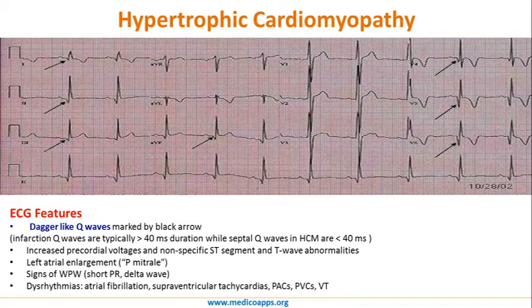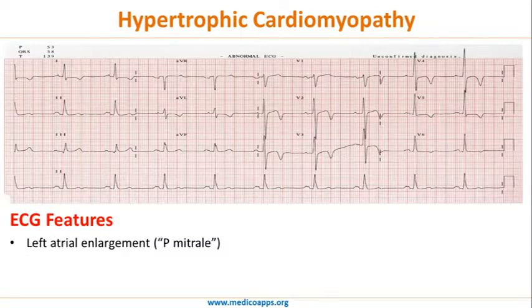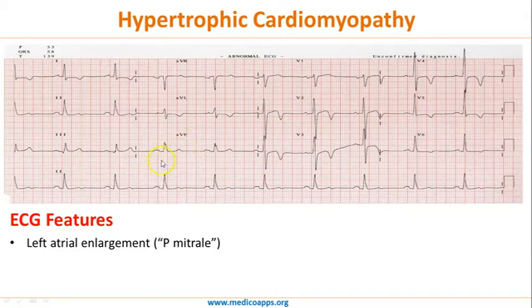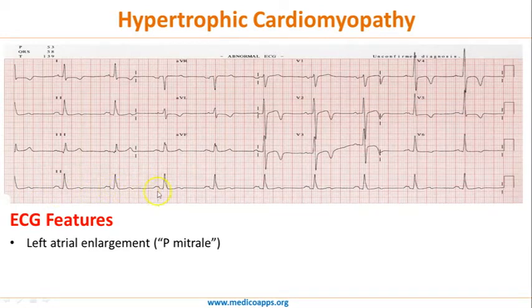Let's look at another ECG in hypertrophic cardiomyopathy. Again, one thing you can see is that the QRS voltage is very high. Second, you can see left atrial enlargement. If you look at the P wave in the rhythm strip to understand its morphology, you see a typical P mitrale kind of P wave. So this again was an ECG from hypertrophic cardiomyopathy.